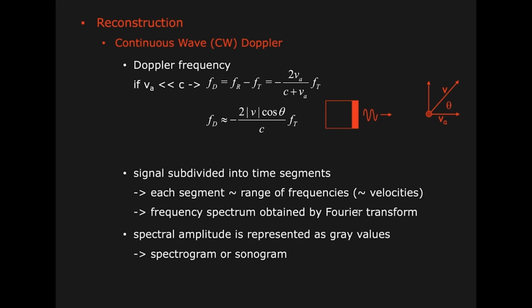Of course, in reality, this is not possible, but the shorter we make the sine wave, the broader our bandwidth becomes, because a very short pulse in the spatial domain is a very flat frequency spectrum. So a short pulse contains all frequencies. So we want at the same time a very narrow frequency, because that's the only way we can measure the Doppler shift.